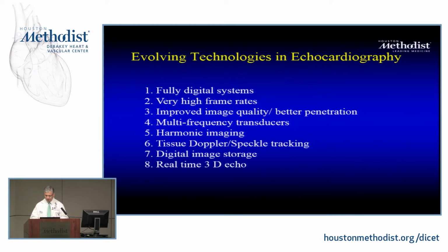So you could see the power of computer technology. So we have fully digital systems. I lived them, believe it or not, before. We used to use videotape, and we laugh and reminisce at times in the Echo Lab of how things were. Videotape from the huge one to the smaller ones, etc. Very high frame rate. In the past, the frame rate, even for 2D, was on the low side. So now you could have parallel processing, image quality, better penetration.